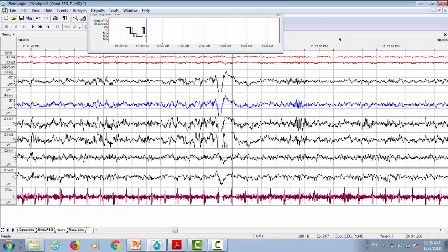And here, this is a tricky epoch. It can be a tonic REM episode, and it can be a continuation of N2. Let's go to the PowerPoint and review those new rules.